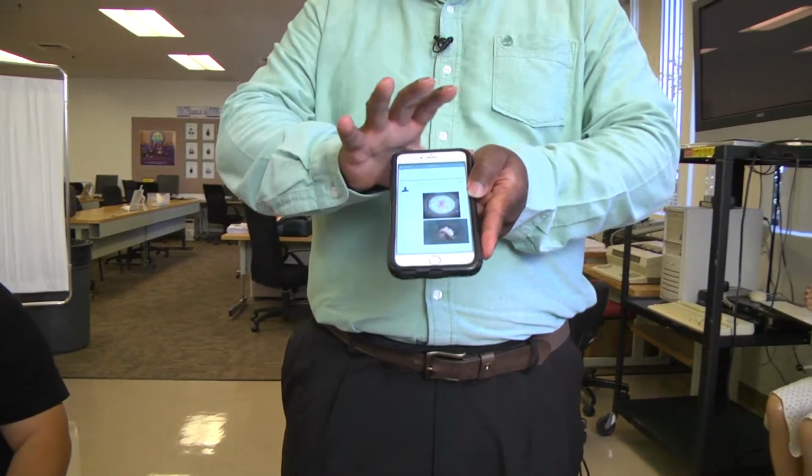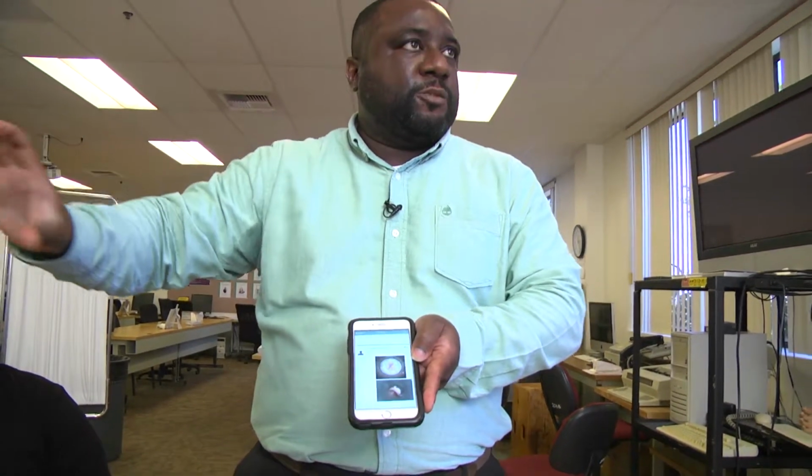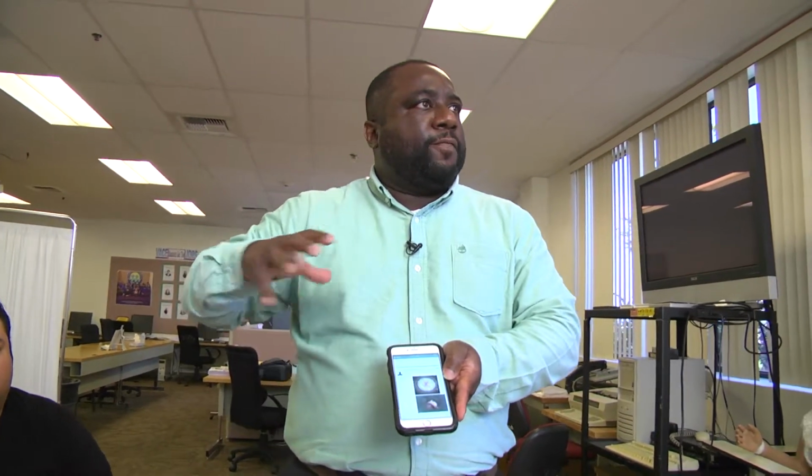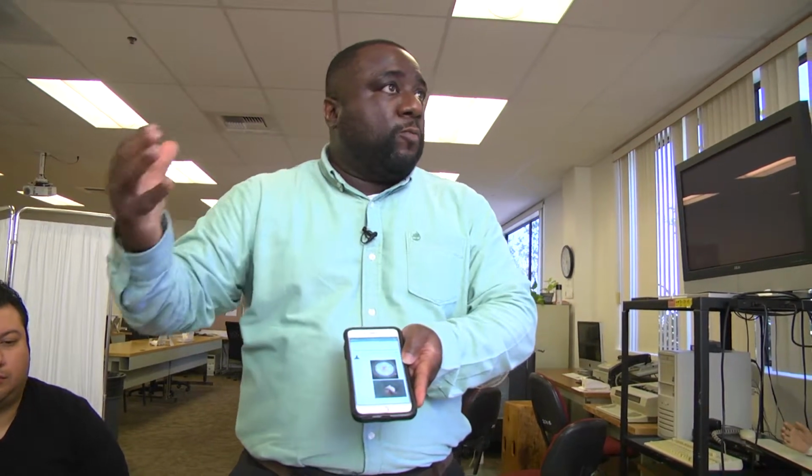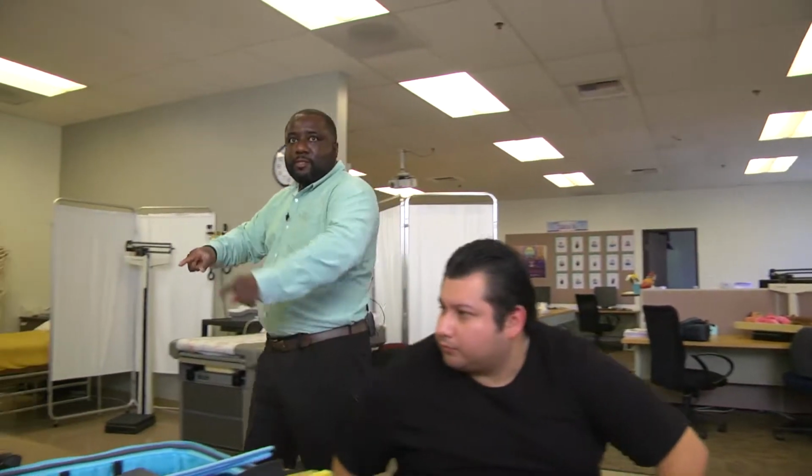Again, these encounters are mirrored as part of the physician portal, so that if the person administering the exam does not have the proper training to make a diagnostic decision, someone remotely can be looking at those exams as they are being administered to make a diagnostic decision, thereby neutralizing the lack of access to medical professionals, the lack of access to care. If you can come here, you can take a quick look at what's happening on the physician side.